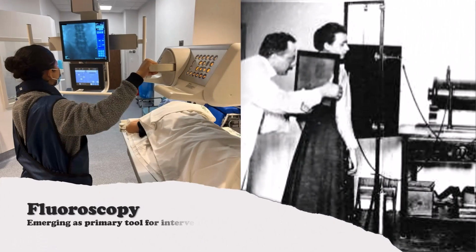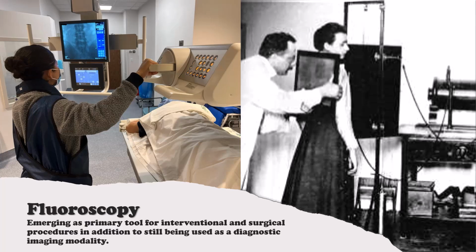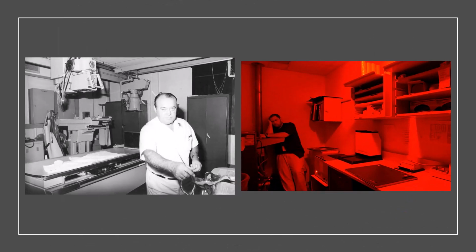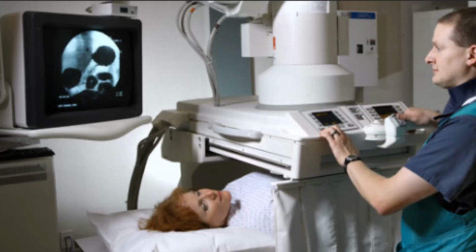Fluoroscopy is emerging as a primary tool for interventional and surgical procedures in addition to still being viable in diagnostic radiology. Fluoroscopy as a diagnostic imaging modality has been impacted by the development and advancement of other imaging modalities in several ways. The use of fluoroscopy for diagnostic purposes has been declining for decades.